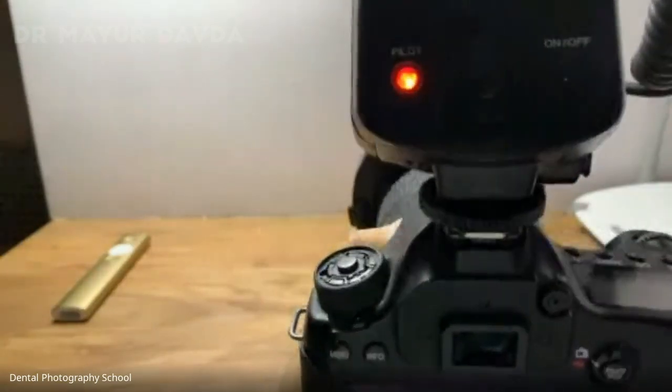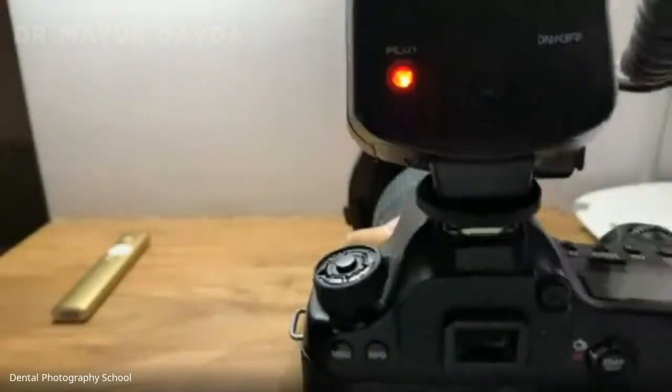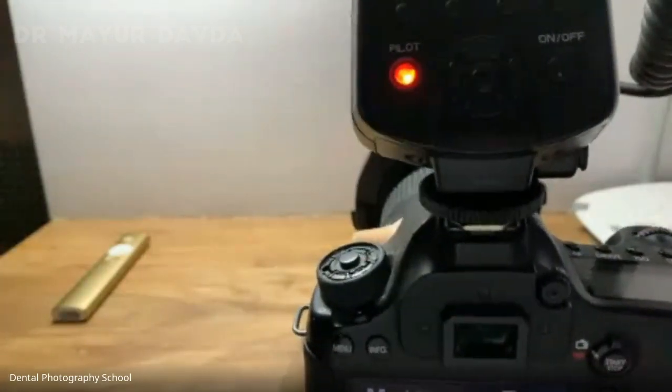All right, so the biggest mistake was keeping the lens on autofocus. Don't keep it on autofocus, keep it on MF. That's manual focus, and set a magnification ratio for yourself. Magnification ratio is there only on macro lenses. It's not there on 18-55 or any of the zoom lenses.